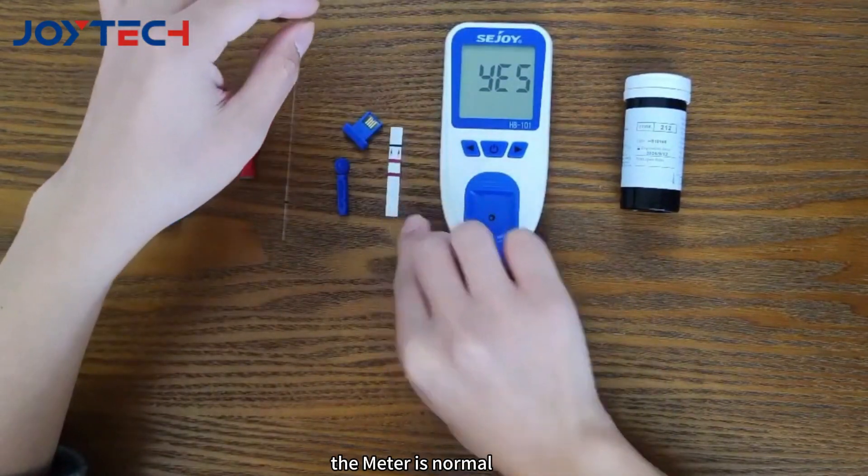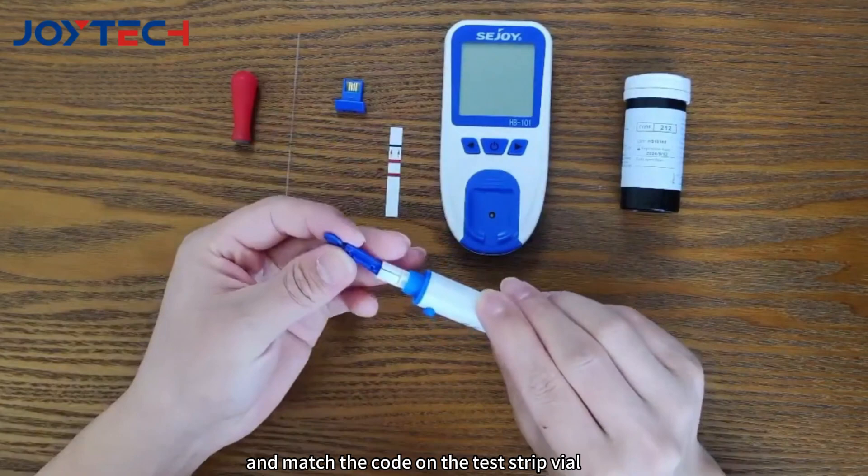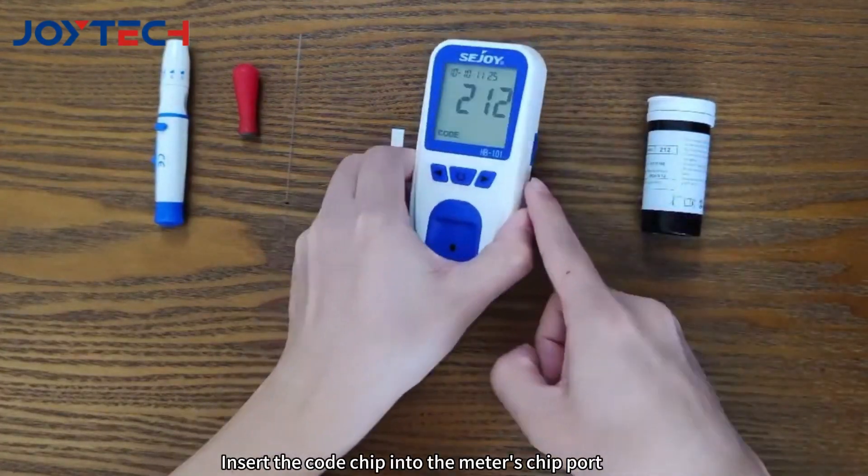If yes is displayed, the meter is normal. Load the lancing device with a sterile lancet and match the code on the test strip vial. Insert the code chip into the meter's chip port.